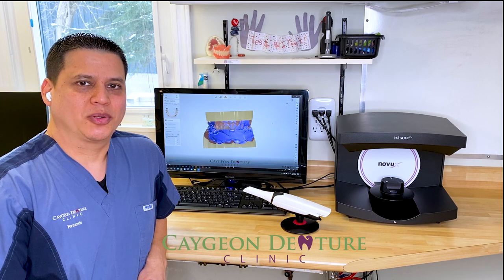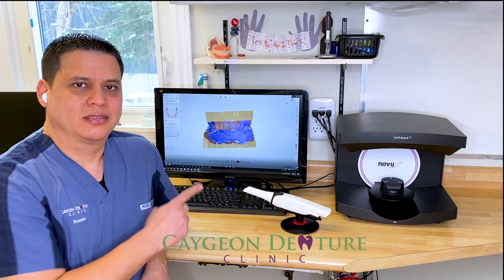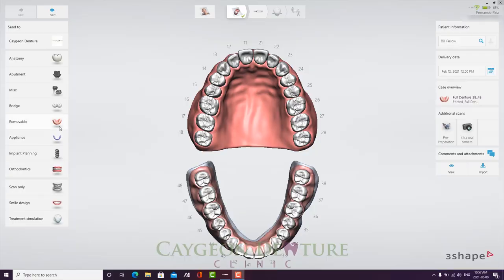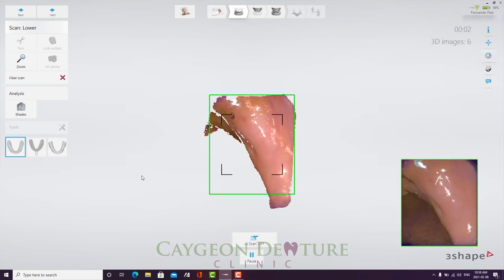And today I'll be showing you how I scanned a new dentureless patient to fabricate a complete lower denture against an existing complete upper denture using 3Shape TRIOS 4. Let's have a look. The first thing is to let the software know what I need it to do. In this case, it is a complete lower denture. Second step is to go ahead and scan the lower jaw.